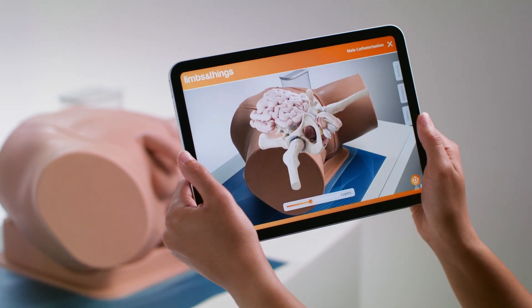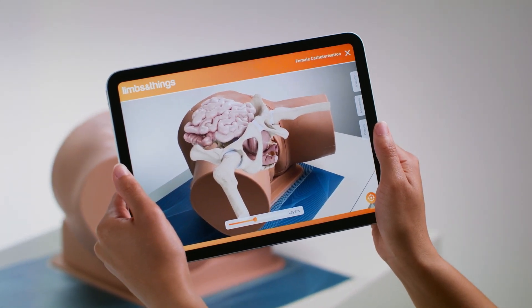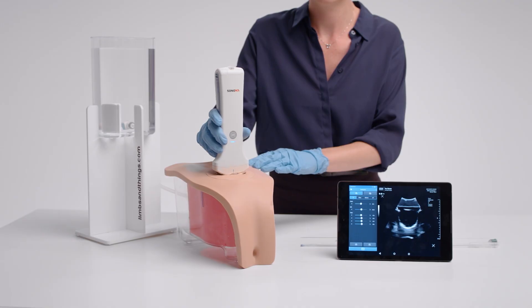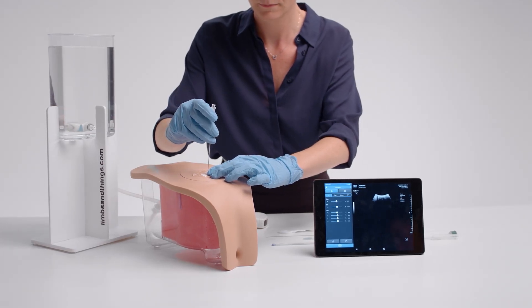Male and female versions show the key anatomical structures needed for successful catheterization. In addition to the range is the ultrasound suprapubic module, designed for advanced skills training, allowing trainees to master ultrasound-guided insertion.